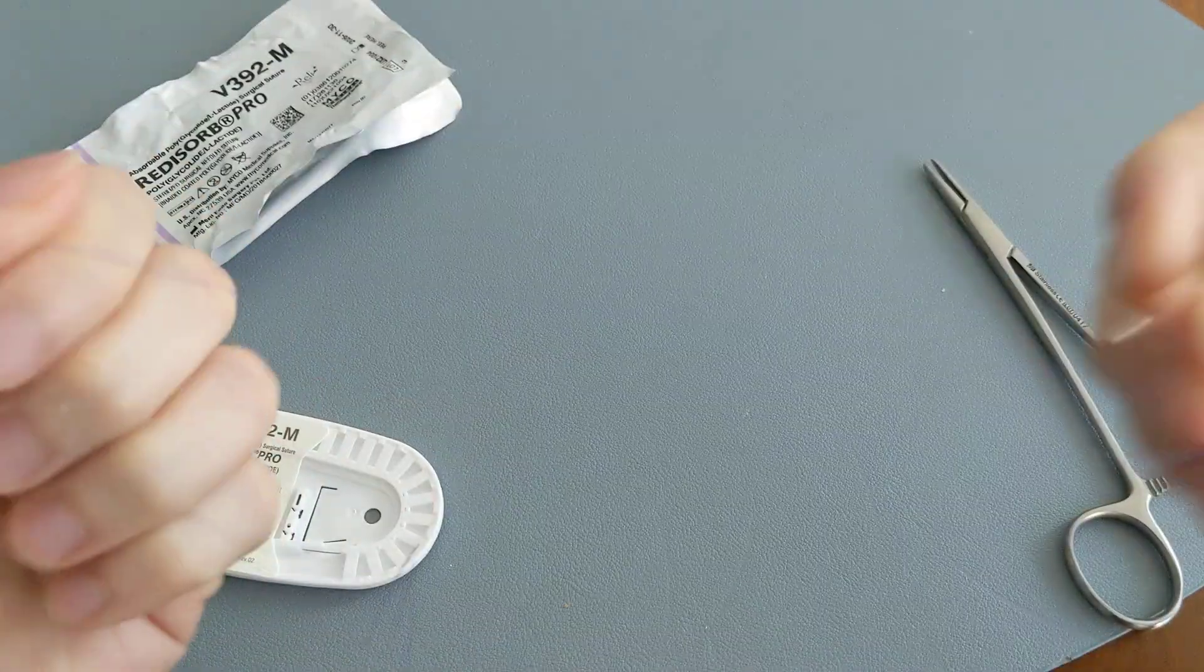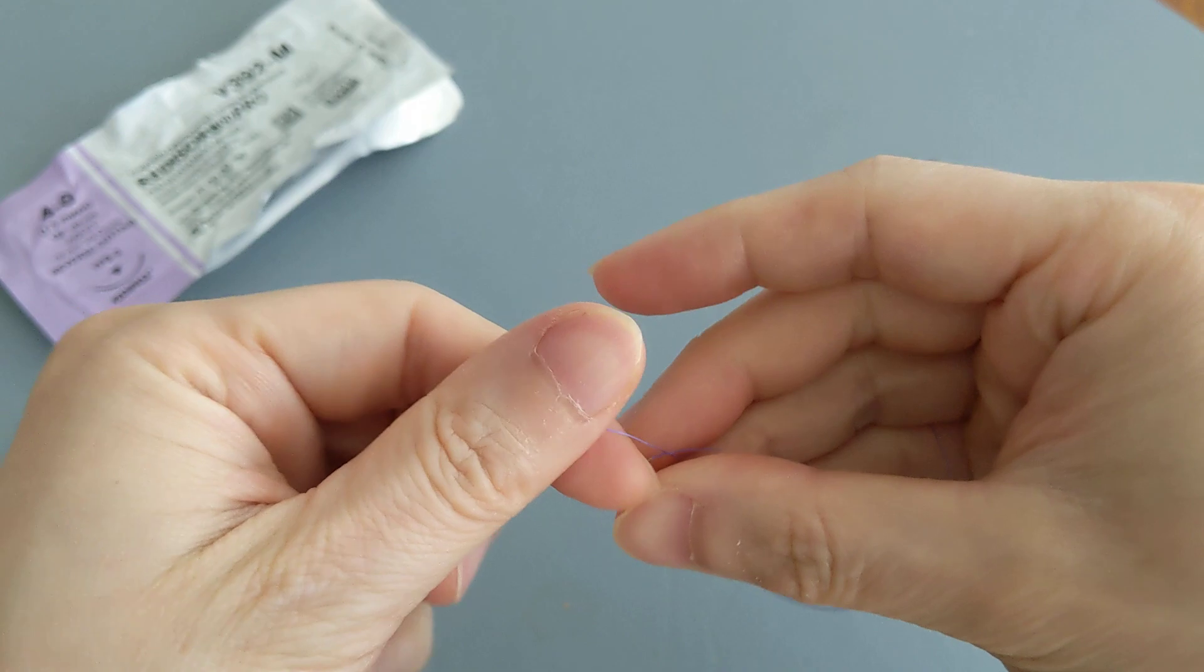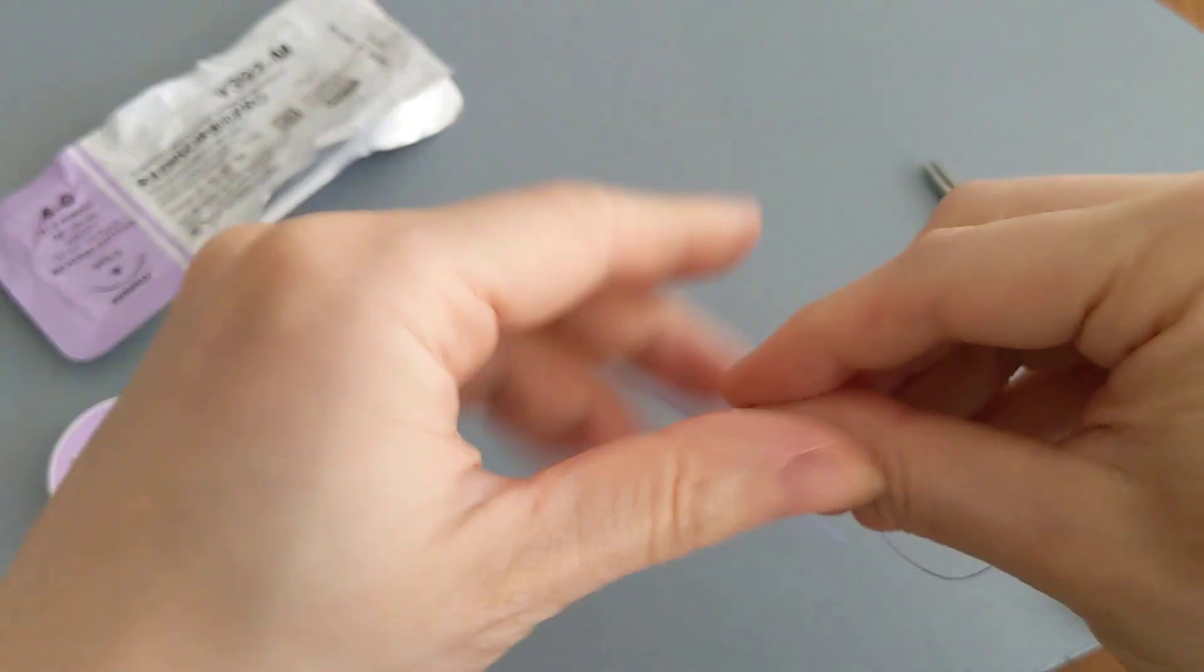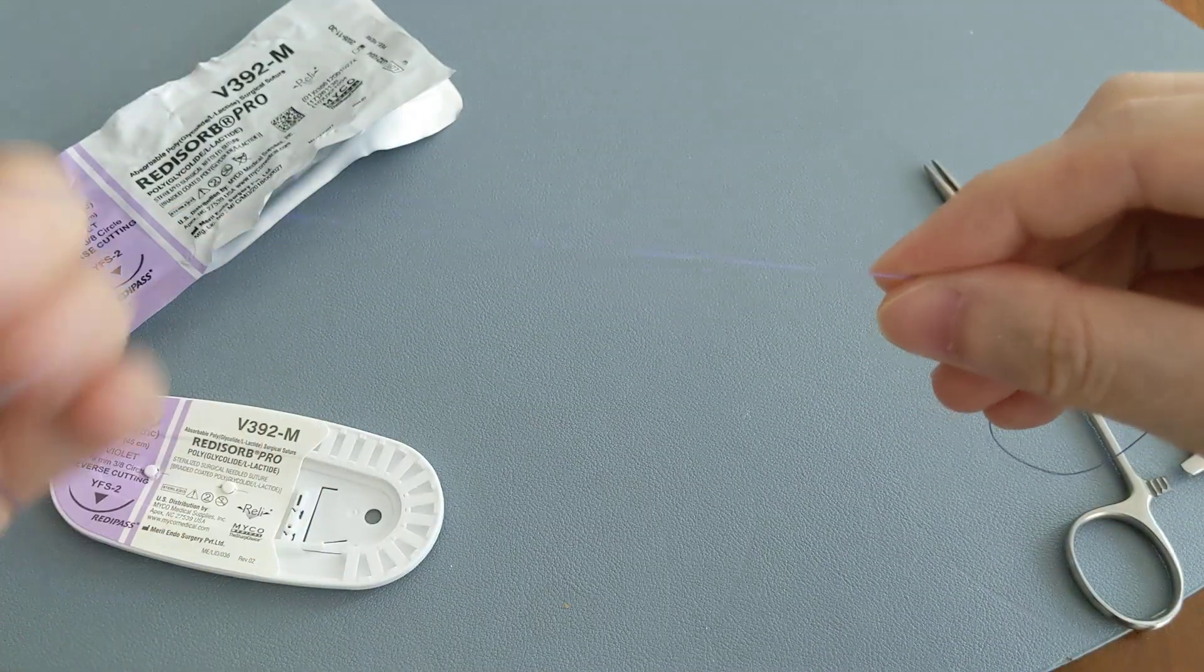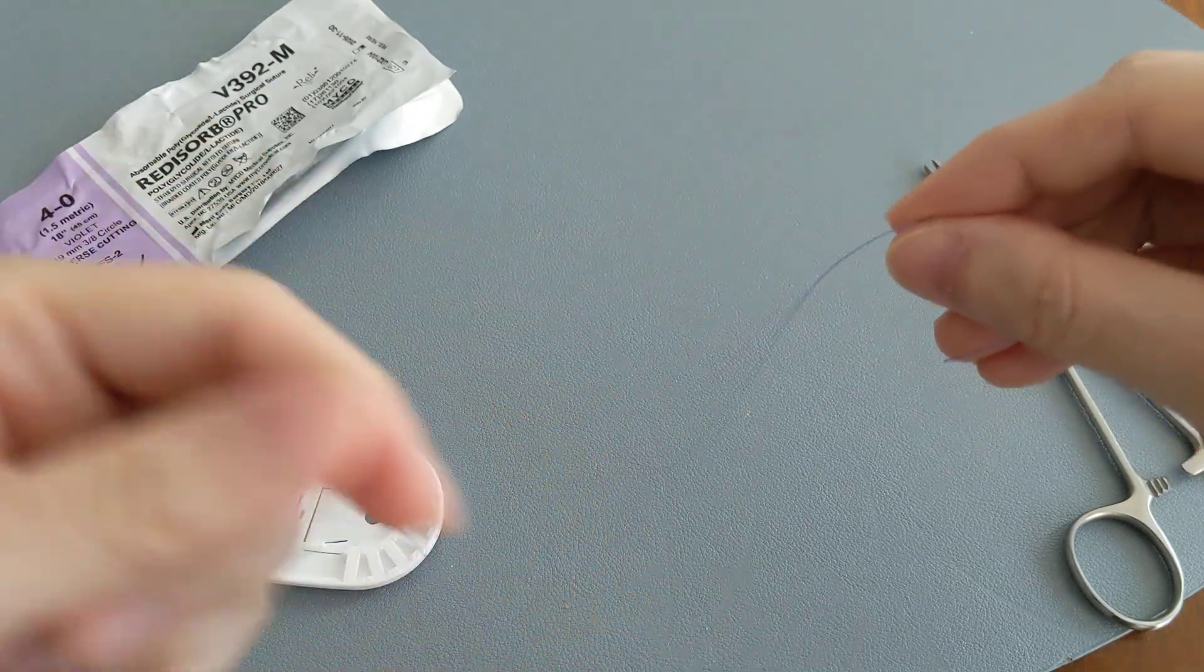So apparently purple stitches are dissolvable and they are made out of PGA. The texture feels pretty good in my opinion, although not quite as soft as the black silks which I do have here.